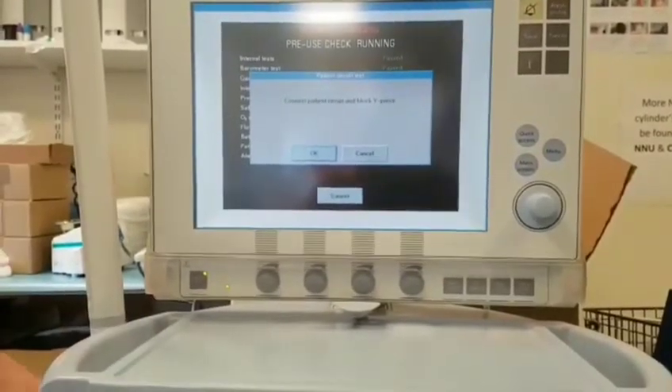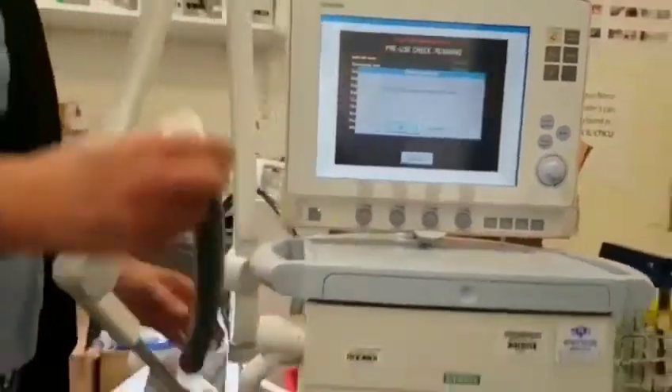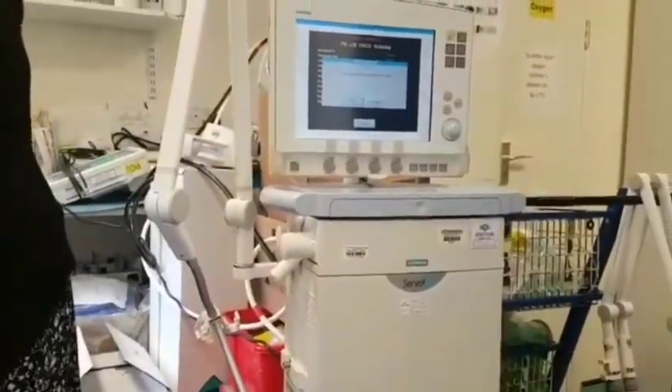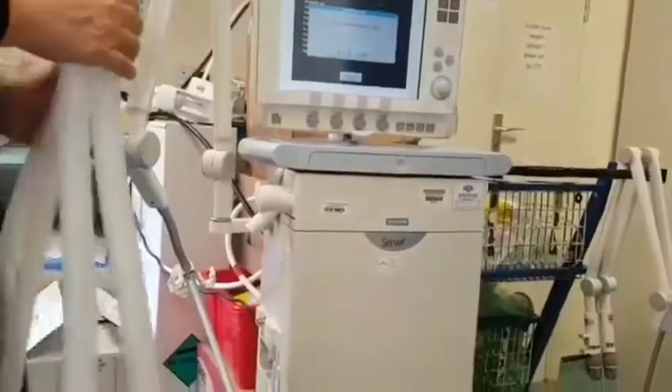Now it's asking us to connect our patient circuit, so we remove our test tube and say OK. Currently we're just using basic adult breathing circuits, so I connect that to my ventilator.